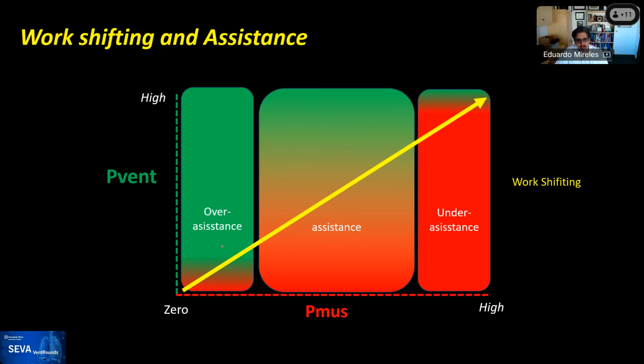But here we're talking about the unintentional, where you have set the tidal volume or the pressure too high, and that has shut down the respiratory muscles. And so the patient is generating very little effort. And the danger of that is obviously muscle atrophy. And I refer here to all the muscles in the respiratory system.